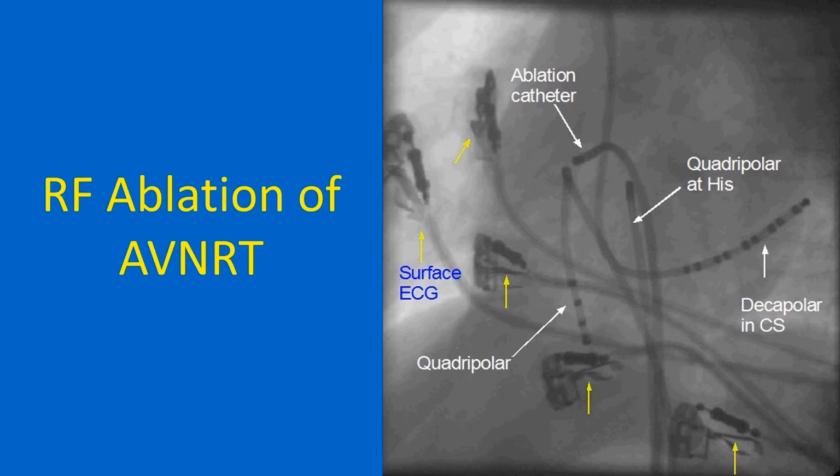The pattern of activation during sinus rhythm is studied initially to identify the sequence of activation. Changes in the sequence with varying pacing protocols are assessed. The ablation catheter is thicker and its tip electrode is bigger, with more surface area for the delivery of radiofrequency energy during radiofrequency catheter ablation. LAO view is foreshortened, while RAO view can pick up supero-inferior catheter tip movements better during slow pathway ablation. Slow pathway ablation is done near the superior lip of the coronary sinus.